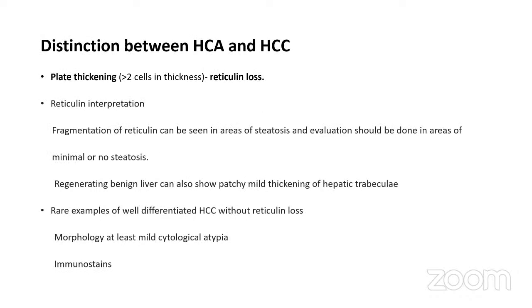So what is the main important distinguishing feature between adenoma and a hepatocellular carcinoma? The most important feature is plate thickening, and that is highlighted by reticulin loss. So reticulin is the most important stain.